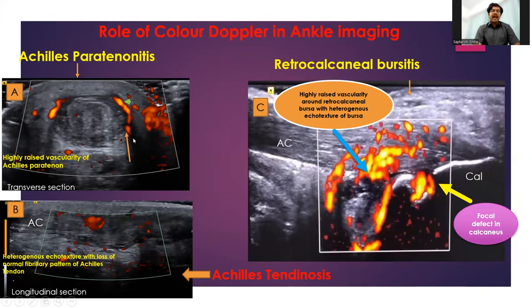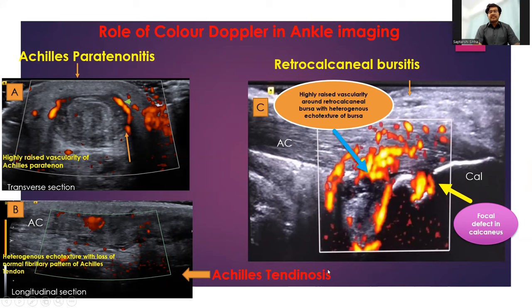Now, the role of color Doppler in ankle imaging: highly raised vascularity of the Achilles paratenon demonstrated in image A is suggestive of Achilles paratenonitis. Heterogeneous echotexture with loss of normal fibrillary pattern of the Achilles tendon with raised Doppler vascularity shown in image B indicates Achilles tendonosis. Image C demonstrates retrocalcaneal bursitis with highly raised vascularity around the retrocalcaneal bursa, heterogeneous echotexture, and a focal defect in the calcaneus.